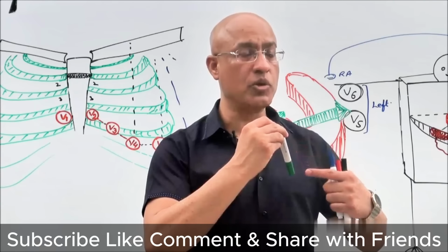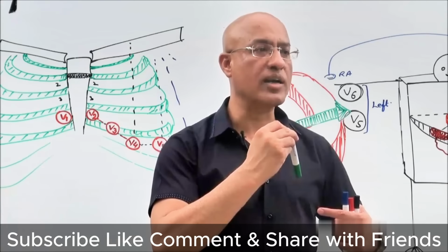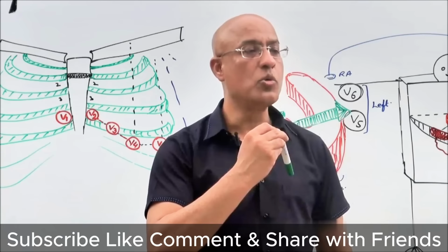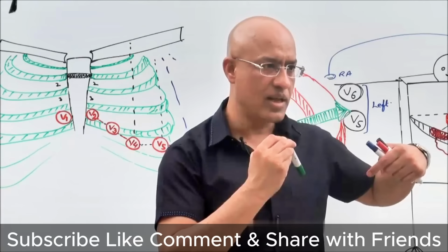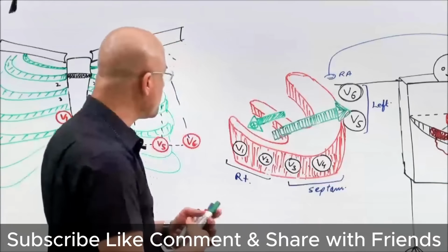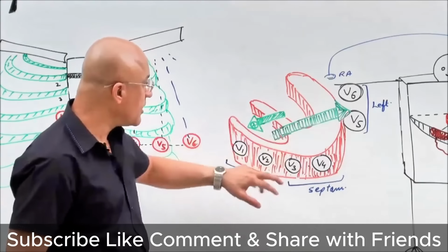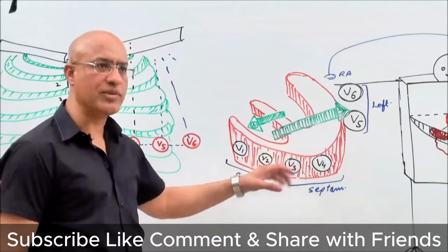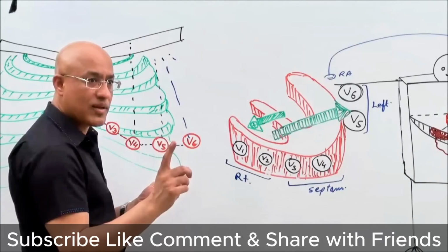Even though left ventricular depolarization moves downward, that component of the vector is recorded by the limb leads, not by the chest leads. Chest leads only record the component of the major ventricular vector moving primarily leftward. Is that right? So it means this is septal depolarization, this is major ventricular depolarization. So I'm showing here two ventricular electrical activity vectors.